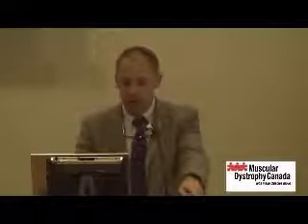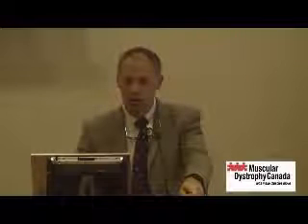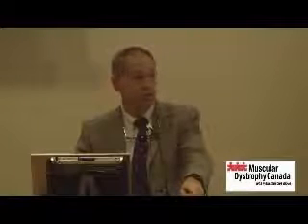So it's not sufficient just to increase vital capacity, as we've done here. As I've shown you, peak cough flow was still inadequate, so adding a manually assisted cough after lung volume recruitment further increases the vital capacity, and more importantly, increases the peak expired flows, sometimes to a very substantial value over what you can achieve with volume alone. So here's an example in a gentleman with Becker's muscular dystrophy.